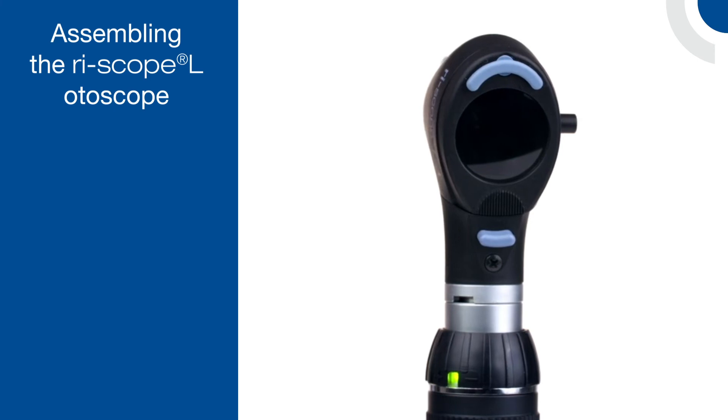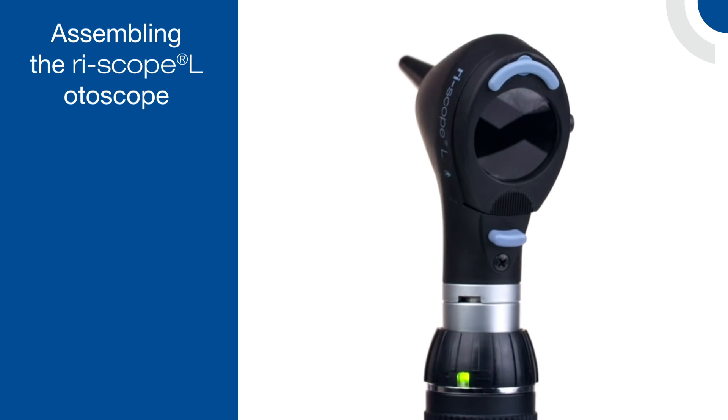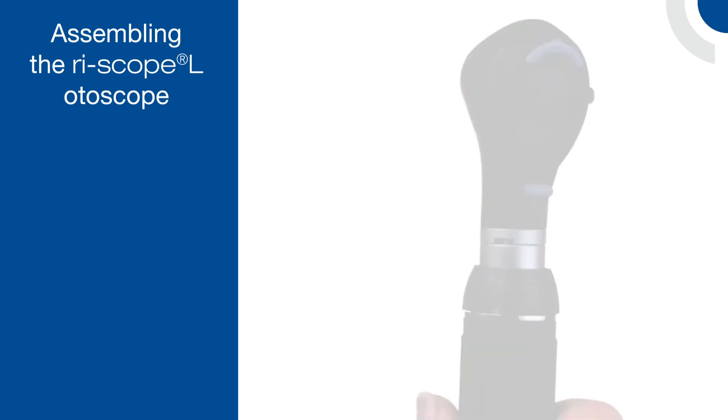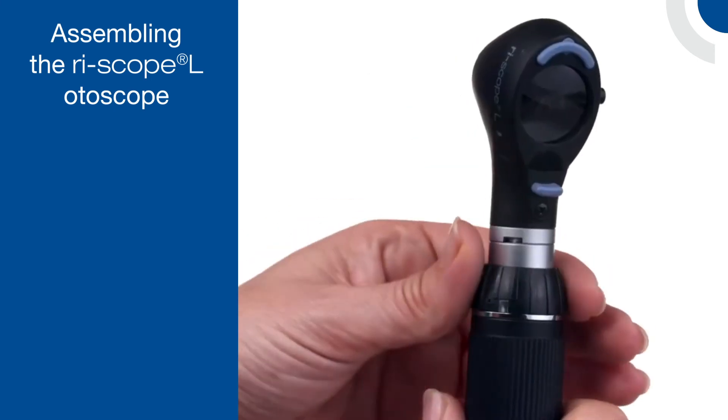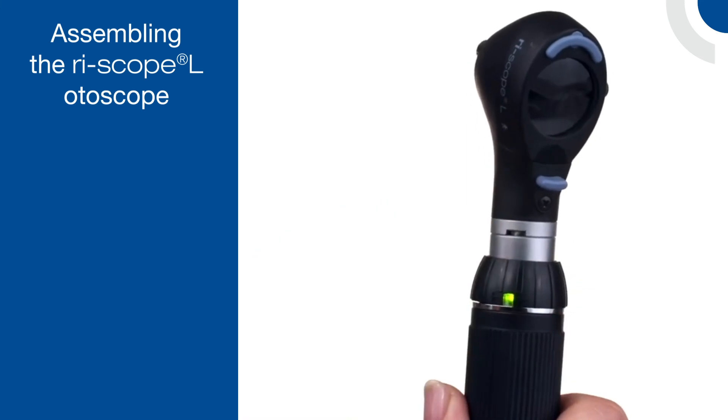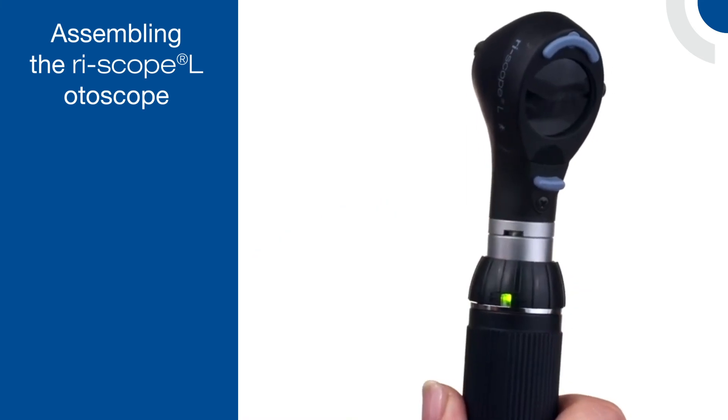Once you have attached the Rescope-L otoscope head and inserted the proper battery, your device is now ready for use. To turn it on, twist the black collar on the top of the handle clockwise.